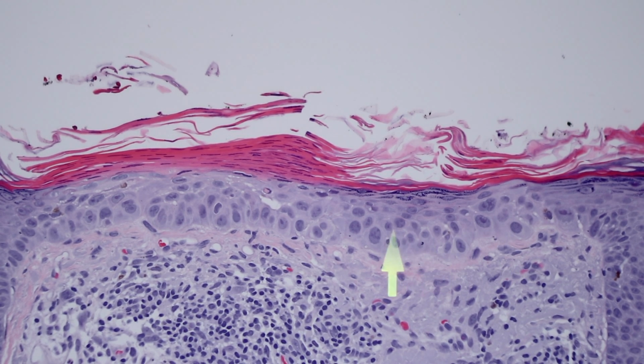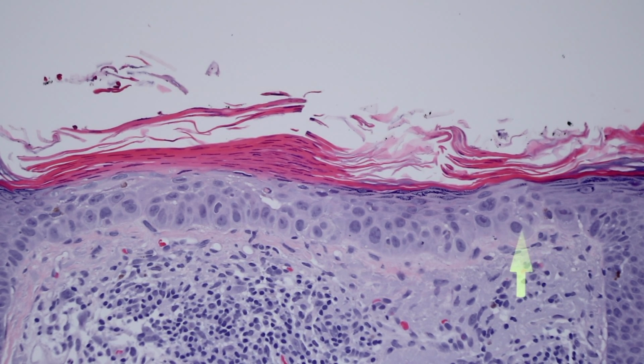Could this be melanoma in situ? Well, I feel like it's almost too good to be true for melanoma in situ. In melanoma in situ the atypical melanocytes are spaced out a little bit, and if they're only single cells, they'll usually be spaced out. If they're totally confluent like this, there's usually going to be nests or unzipping of the epidermis from the dermis, other signs to show you that you're dealing with melanoma in situ.